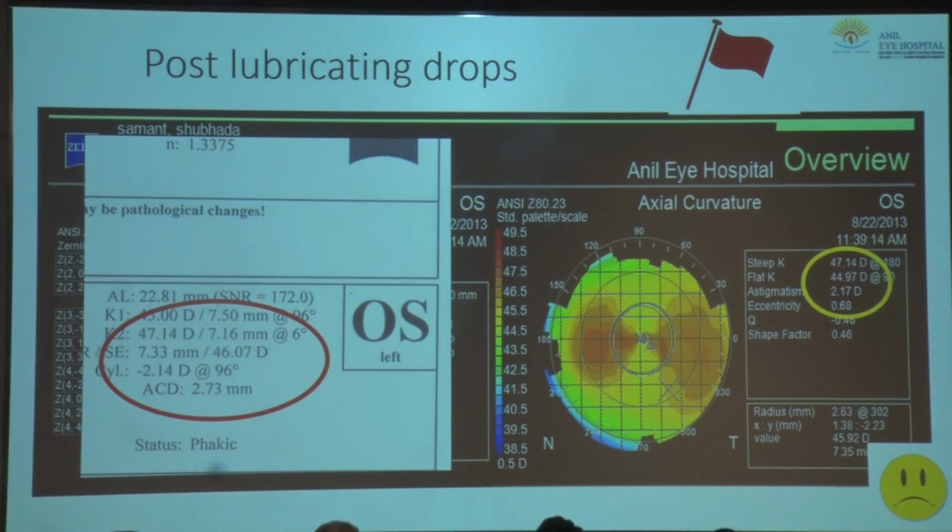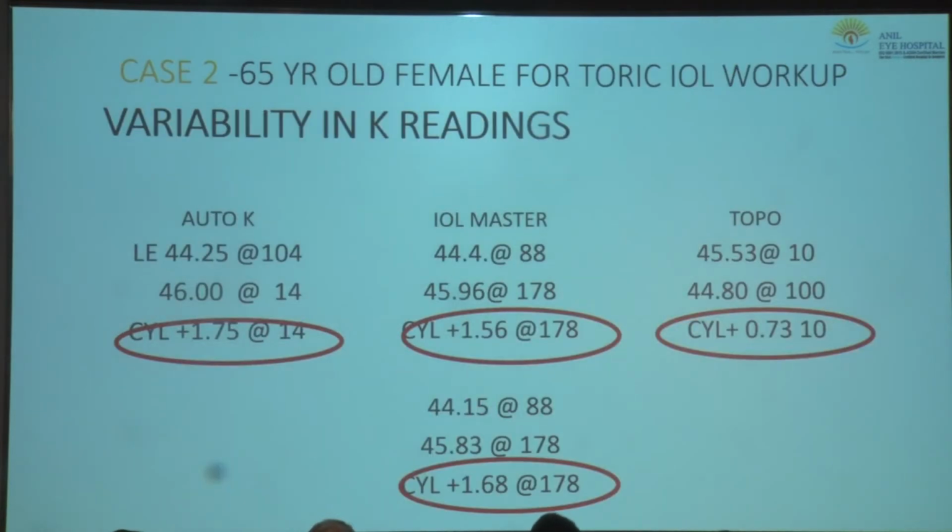I would go ahead and say, in today's day of using masks and so many other problems like excessive exposure to digital devices, every patient you should consider as a potential patient of dry eye. So for all these patients, especially if you are planning premium IOLs like torics or multifocals, you have to do a topography and also look at their ocular surface.